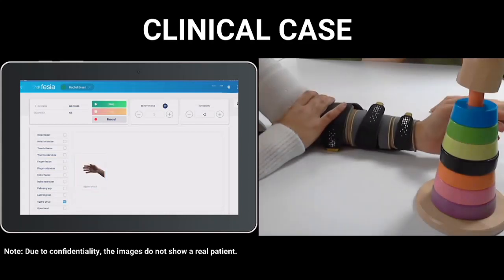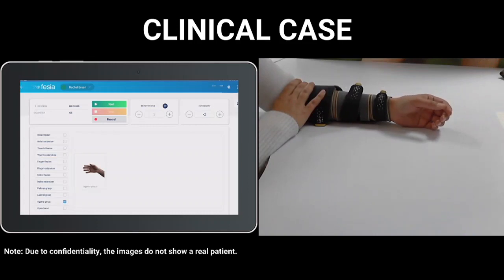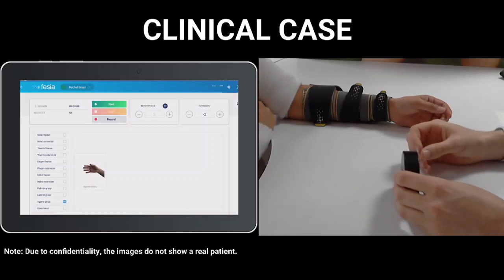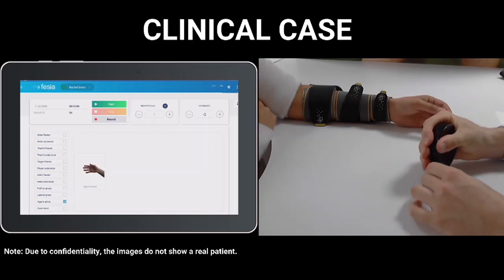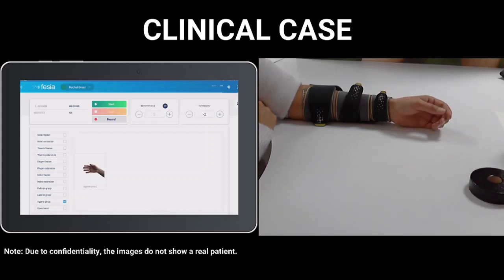Perfect. Let's stop it now. And we are going to train another functional movements preset in the Fesia Pro application, which is the palmar grasp. It is important that you know that it is going to extend all your fingers. It will flex your fingers and then extend them again. First of all, we will do it without an object.